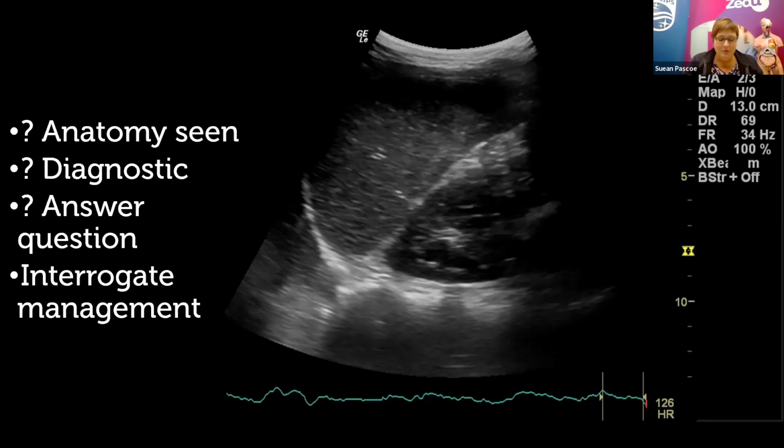Now, the point about this is that she got the answer right, and I got the treatment that I needed in a very timely manner, thankfully. But I looked at the pictures and they were garbage. They really were not very good pictures at all. I couldn't tell if it was a right upper quadrant or a left upper quadrant or even the bladder. A lot of them were overgained, we couldn't tell liver from spleen, and there was fluid everywhere. So that didn't help either.